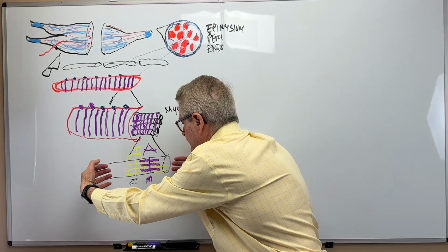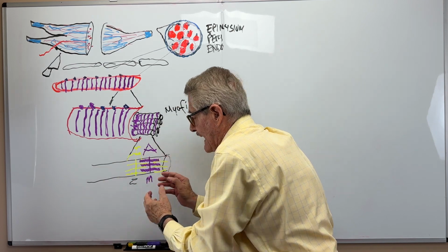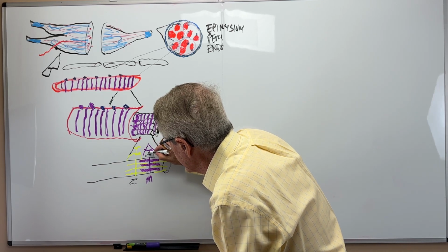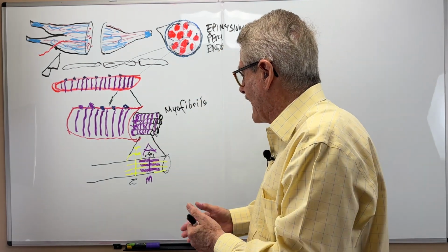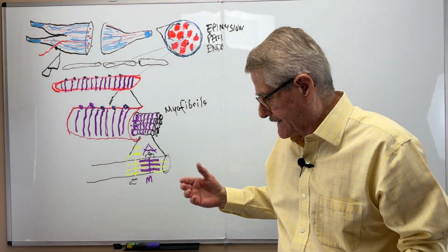That way, for example, the yellow filaments, or the actin filaments, will go in, and there's an extra little area called the H band, for "hell" in German, which is clear. That way you are getting an idea of why the skeletal muscle is like that.